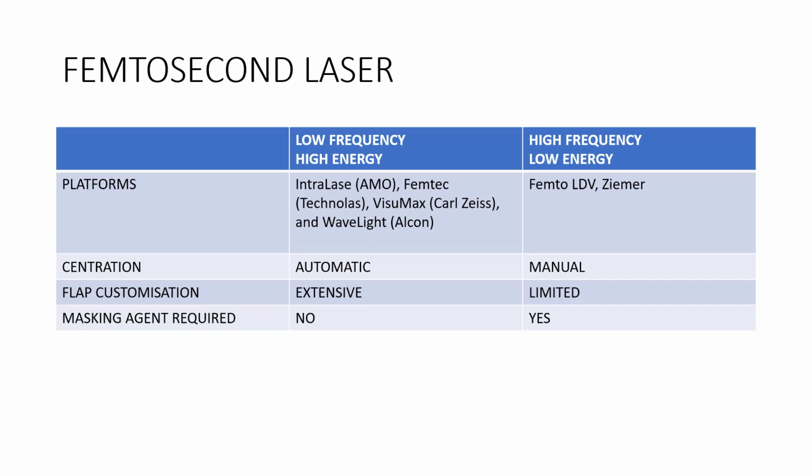Okay, sir. So, femtosecond laser, there are two types of femtosecond lasers available. One is low frequency, high energy, and the other is high frequency, low energy.